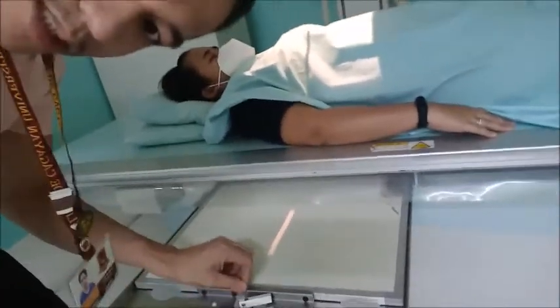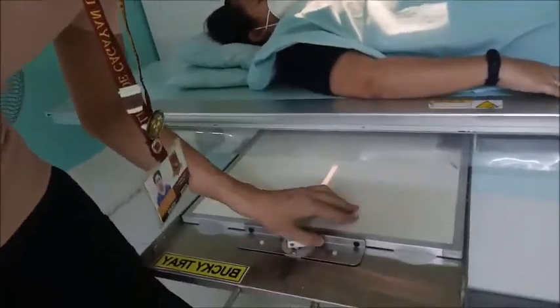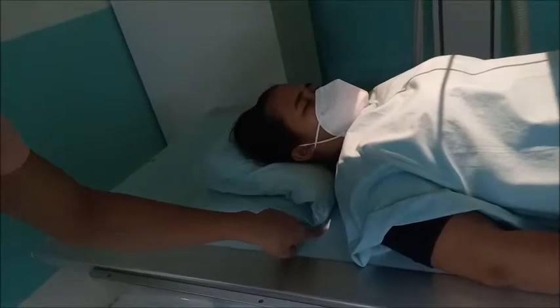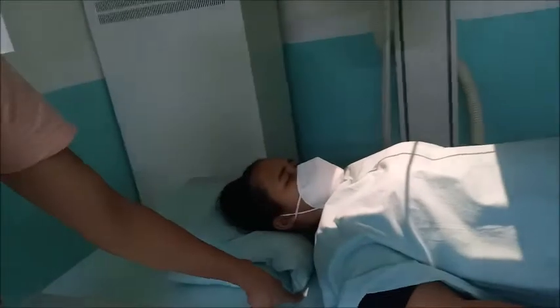So again, you have to same dito sa atong chest baki. You have to lock it in place. Kani, this is the release. This is to lock. Again, katong nay duha ka buok diba nga clip niya in order to lock it in place. And then adjust the position of the patient and also the collimation pagsad. So nagya po border approximately 1 to 2 inches gyapon nga border niya kabantay mo na top of the shoulder ni patient nakita pa nga naay nitipas nga collimation. Siya. So that means dili ka ma-cut off ana sa imong T1.